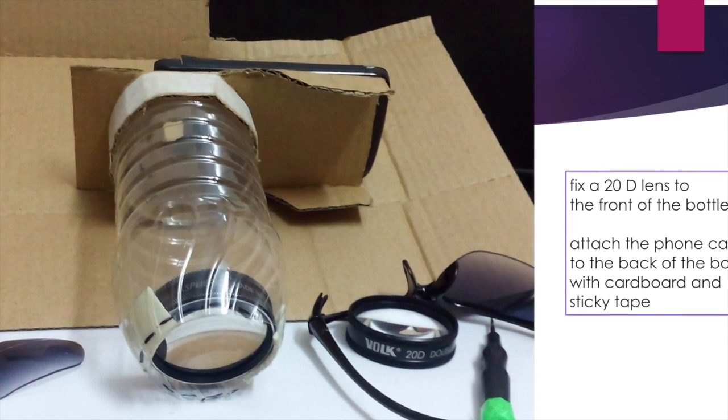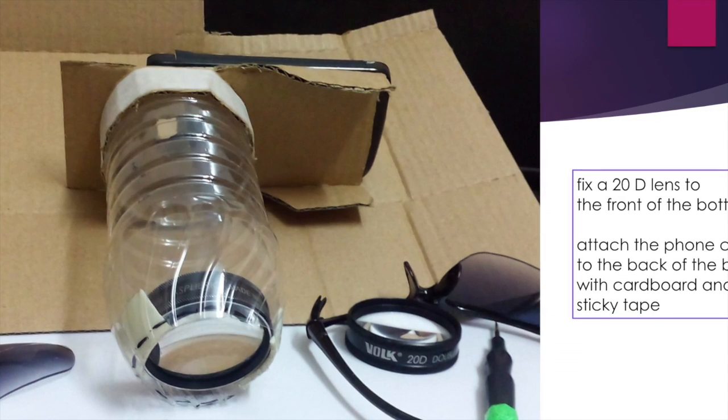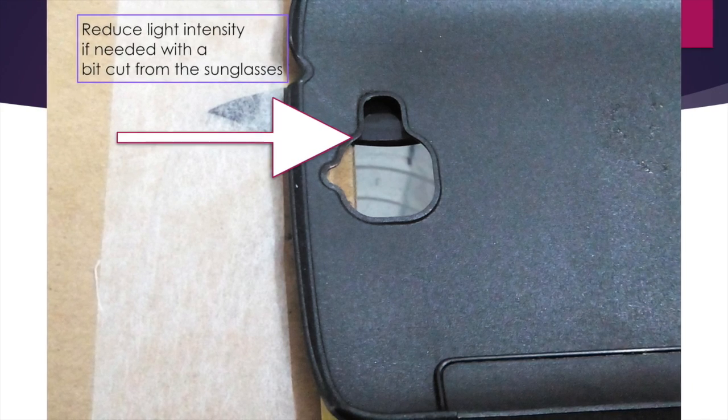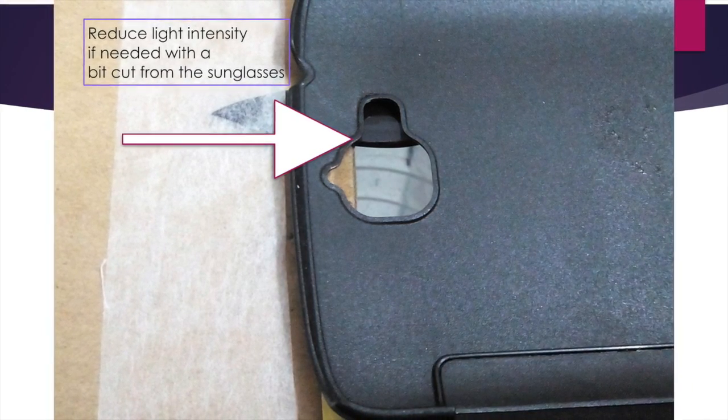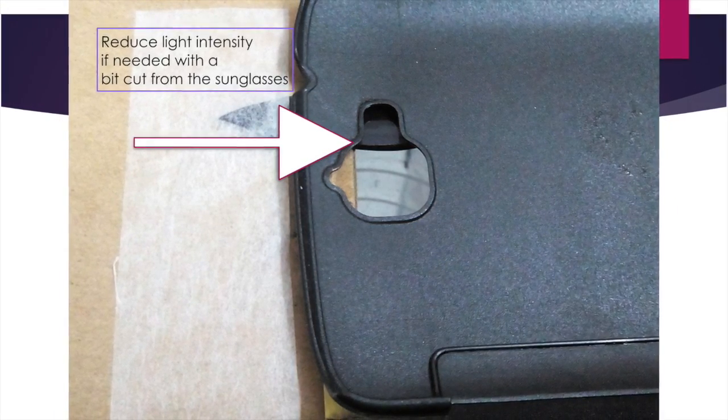In the back of the same bottle you can fix the cardboard piece and attach the smartphone case to the opposite side of the cardboard piece. You can reduce the intensity of the light if needed with a bit cut from a pair of sunglasses.